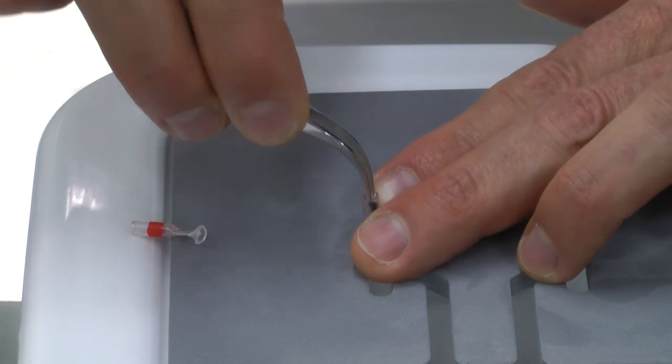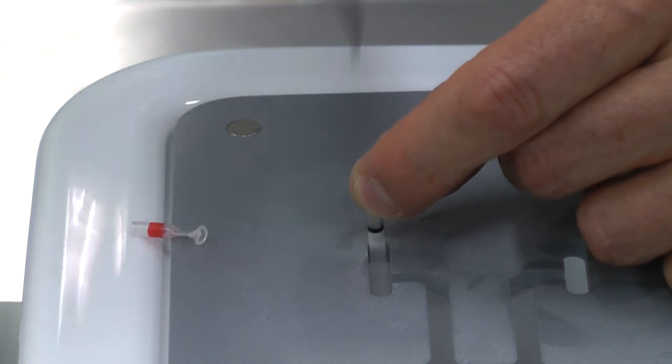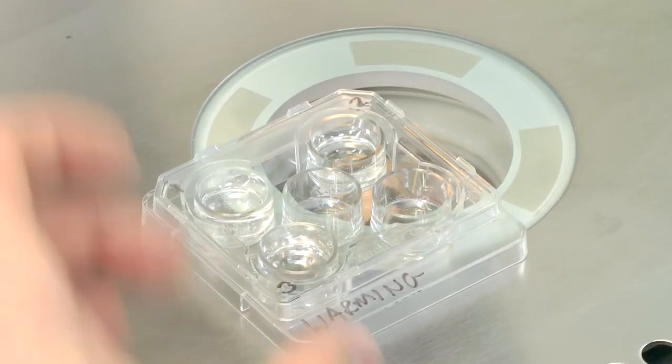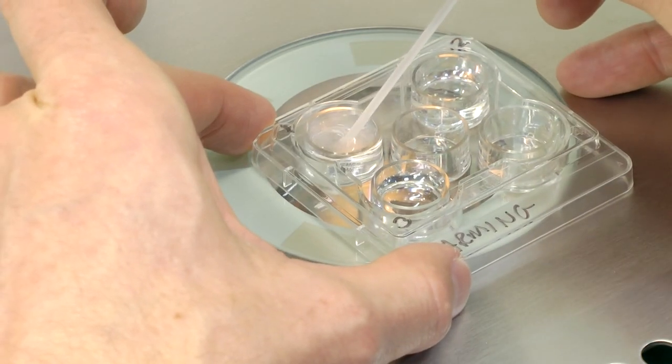Lift the RapidEye out of the straw using the forceps, just high enough so that you can grab hold of it with your fingertips. Remove the lid of your dish and in one quick movement, place the RapidEye inside the first solution.